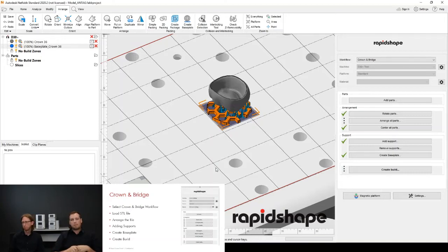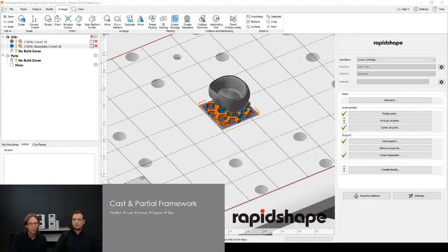Again, this depends on the settings of the supports. If they are positioned over one of the holes of the platform, it could risk failing. But with the base grid, this is not a case to worry about. Okay, I don't see any questions, so I think we can just keep moving forward. Yes, of course. Robert? Let's see what we got next on our agenda.